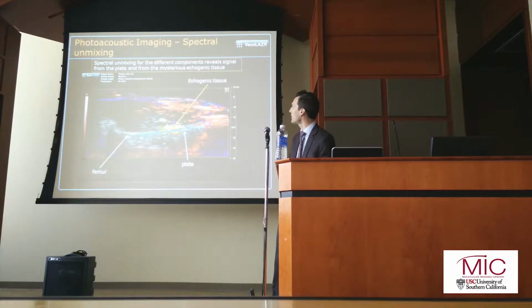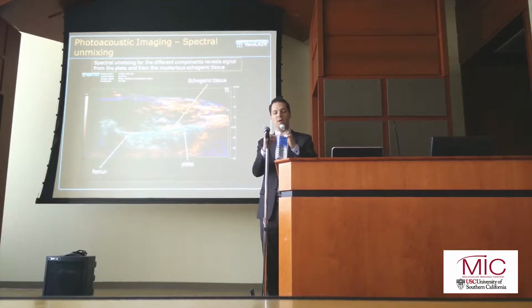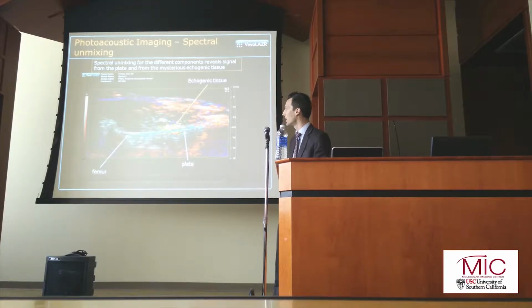And I kind of like this image. This is an image that we acquired at a demonstration where they've got a fracture model. So they introduce a small gap where the break was, and they want to see what's going on in that gap as far as the healing of that and so on. So they wanted to image this and see what they could see.